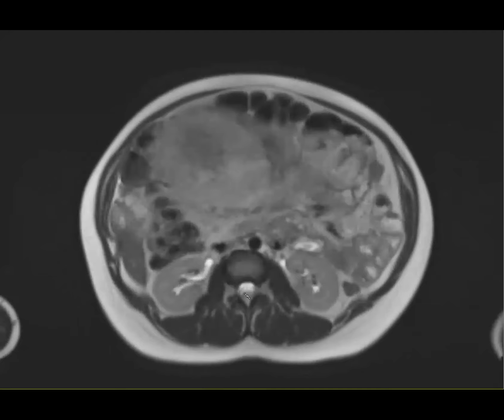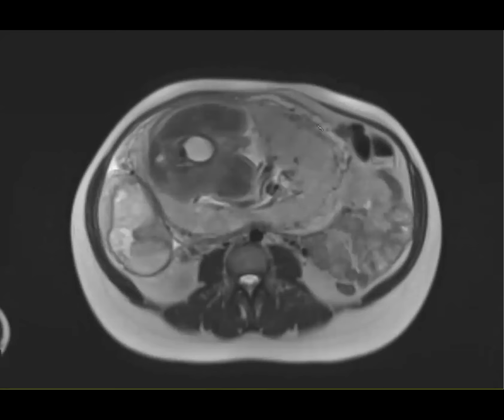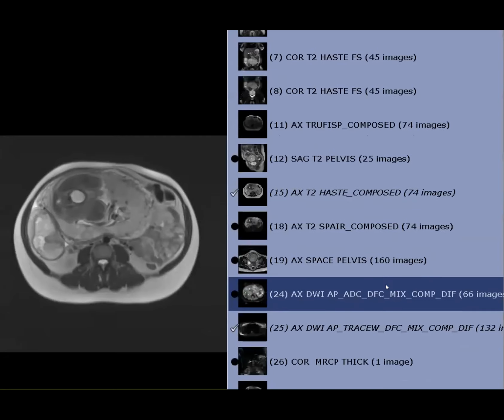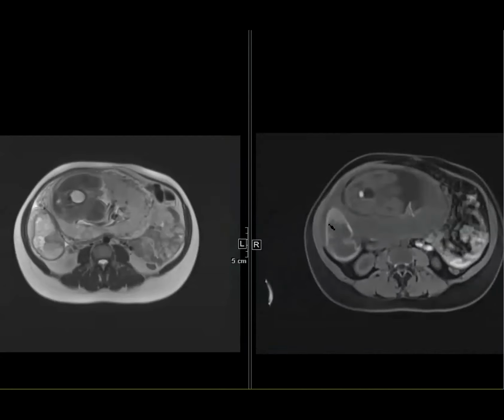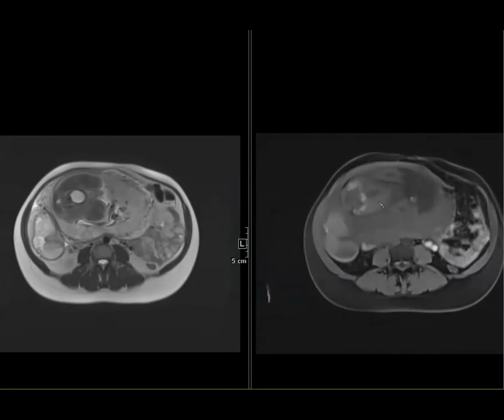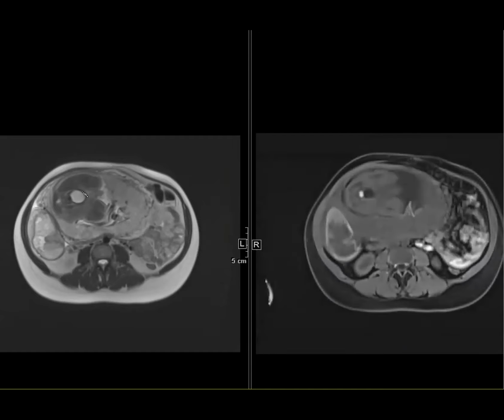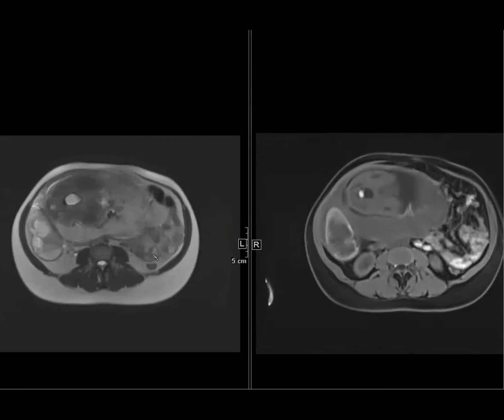Right lower quadrant pain. So this is the fetus and the uterine cavity, and then I will show you maybe the T1 as well. Definitely a mass there in the right lower quadrant. Yes, good. There is this mass here in the right lower quadrant, and it has some T1 hyperintensity. We did not give contrast. You can also see a little bit of T1 hyperintensity within the fetal bowel, which is kind of normal. So where do you think this mass is? Probably the right adnexa. Yeah, exactly.